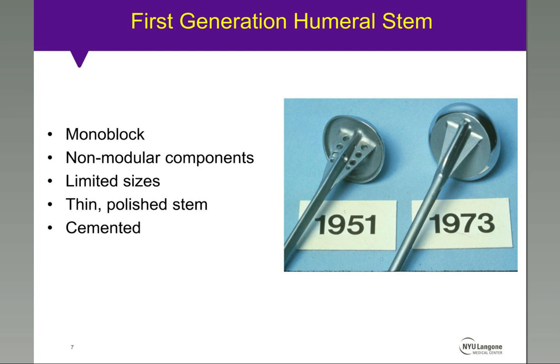With this stem, it was challenging to recreate proximal humerus anatomy and soft tissue tension in some patients, and this led to the introduction of the concept of modularity.